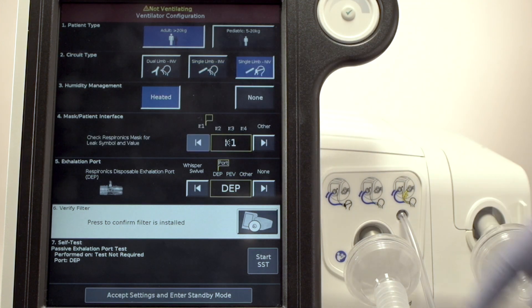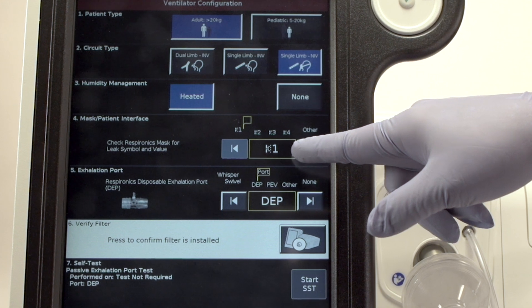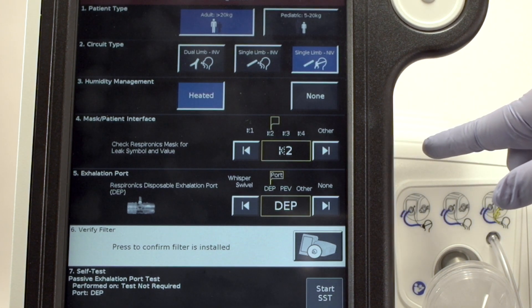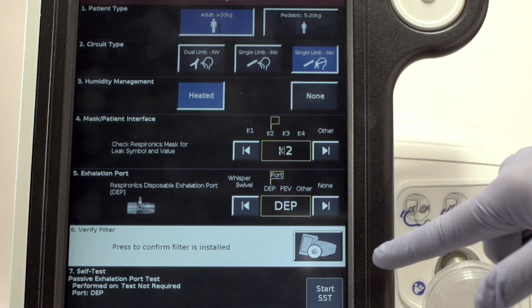Next, select the Leak symbol that corresponds to your Philips Respironics mask. If you are using another manufacturer's mask, enter Other. Next, select the Exhalation port.